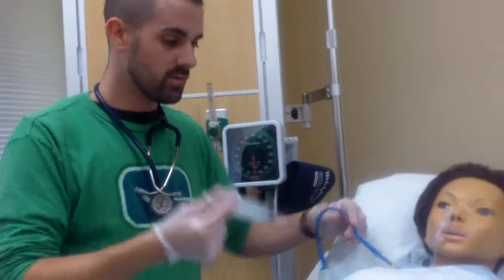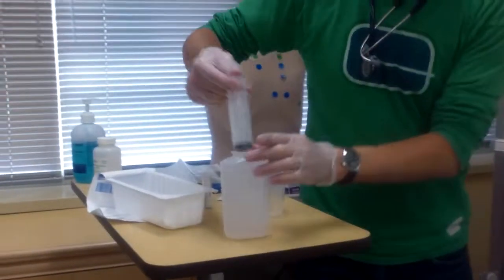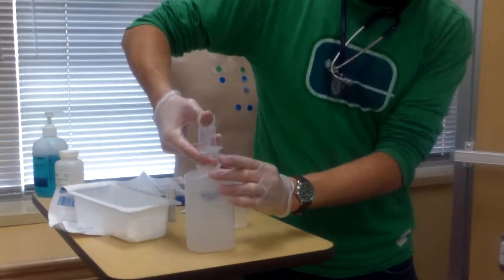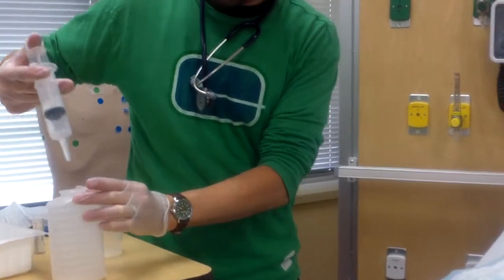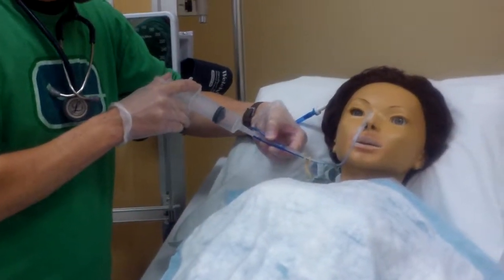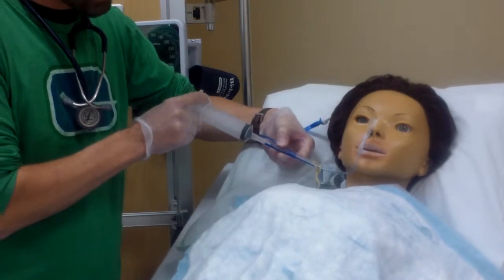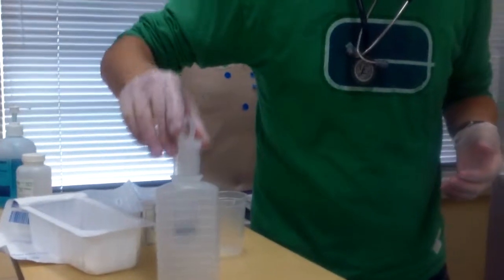And now I need to flush it before I do the medication because I need to make sure it's patent and there's not any kind of blockage. So this is where I do the 30 ml. Alright, so there's 30. Now I'm going to flush it with 30. There we go. So now it's flushed. That's good. Now it's time for the medication.